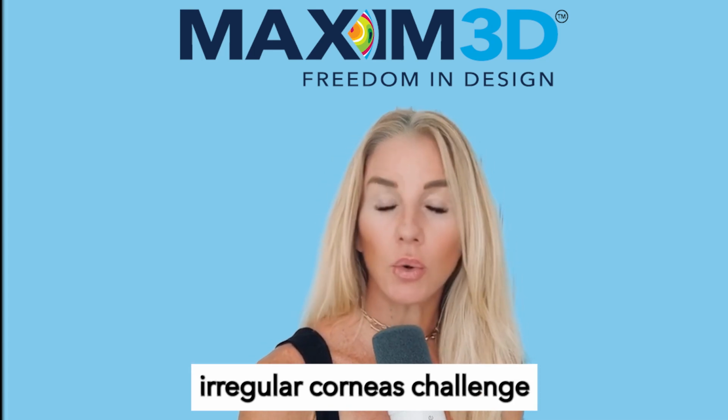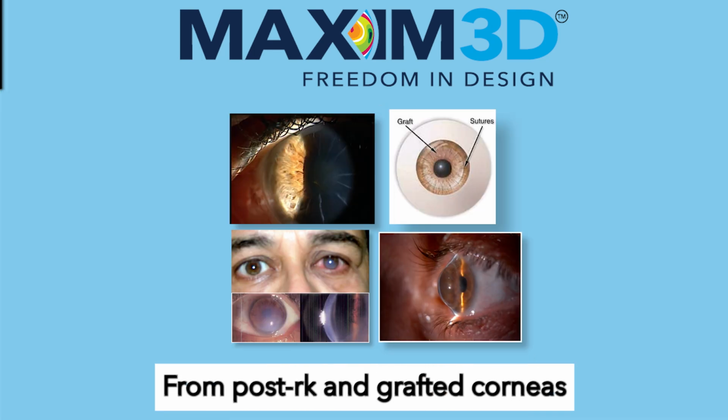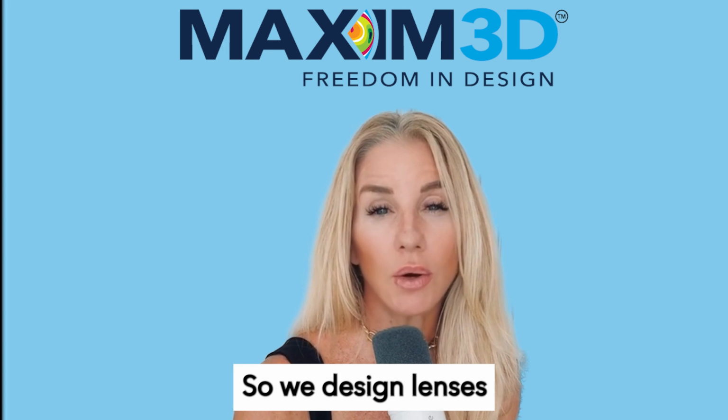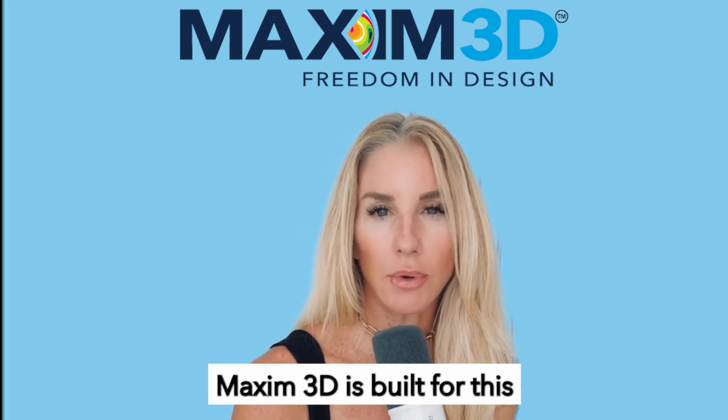Post-surgical and irregular corneas challenge even the most experienced fitters, from post-RK and grafted corneas to PMD and LASIK ectasia. These are eyes that break the rules. So, we design lenses that break the mold. Maxim 3D is built for this.